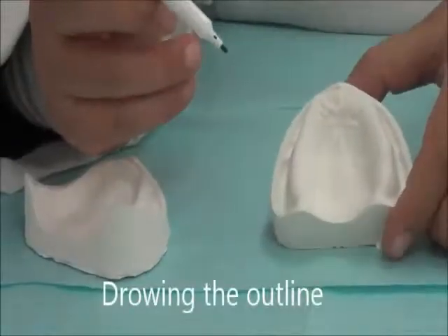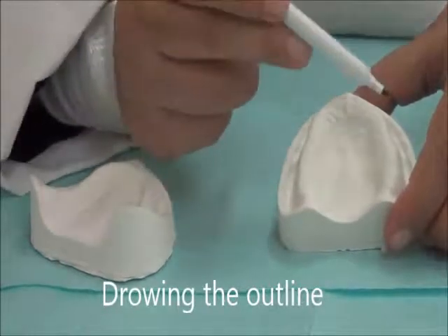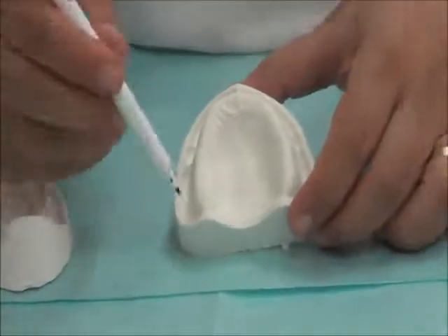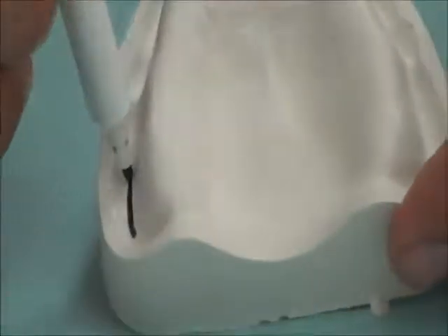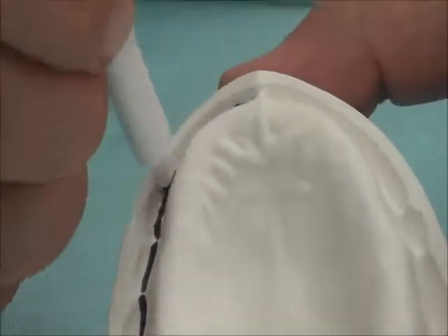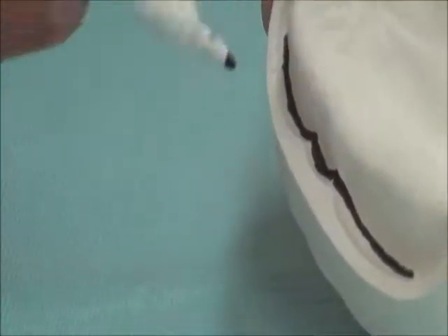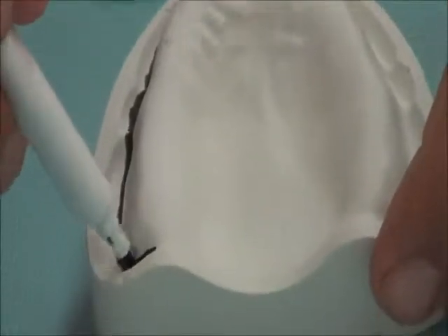So to begin our first step, we need to outline the basal seat area, which is the area that could come in contact with the denture. We begin by holding a pen. We need to know where the depth of the sulcus is. So we hold the pen vertically and we let it run in the sulcus all around the cast. We will find that on the areas of the freni, the pen will go up and down. This is the sulcus morphology around frenal attachments. We also go inside the hamular notches.